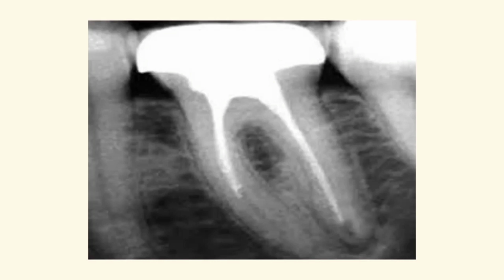Ledge formation again. You can see that there is one thing common in all these cases, that treating clinician is not able to reach the anatomic apex. Reason may be a ledge formation, canal blockage, wrong instrumentation, whatever, which results in the failure to create a glide path and a patency.